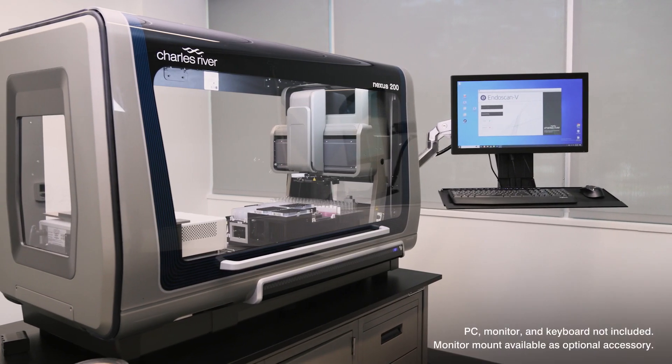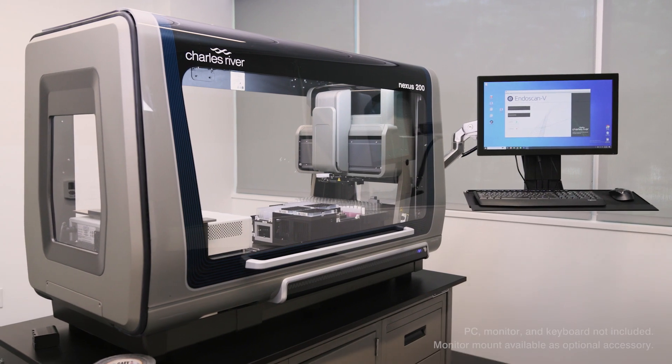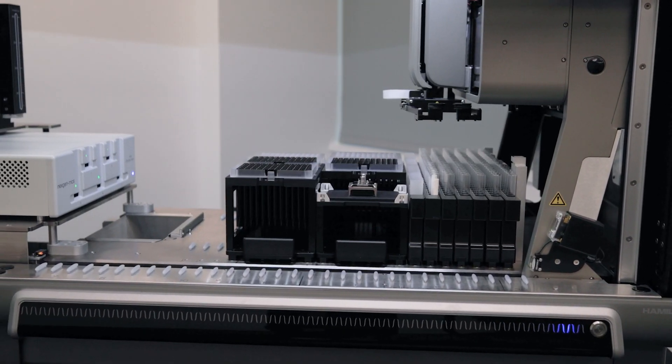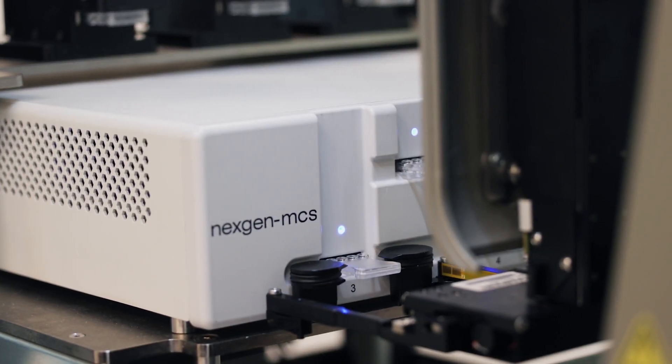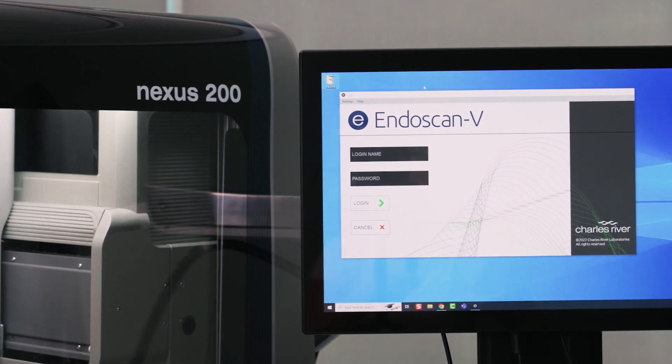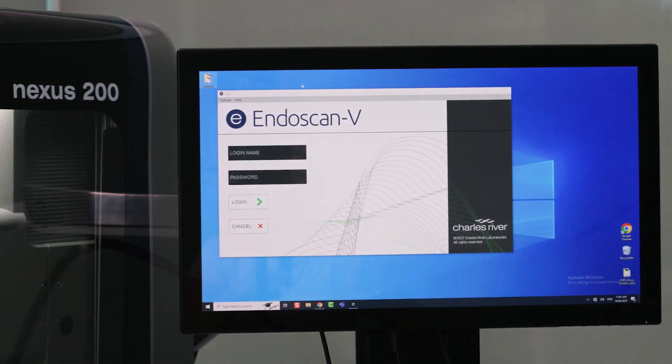The Nexus 200 system was purposefully designed to automate all the critical steps for testing samples for endotoxins through automation, reducing the risk of repetitive strain injuries, decreasing human intervention, and ultimately reducing lab investigations.